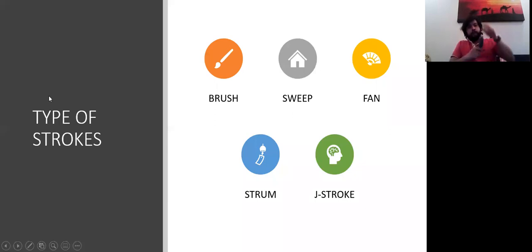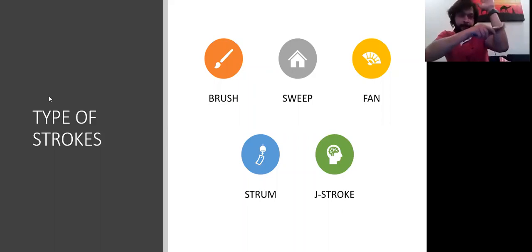Yeah. So let's say I'm treating a part, and for now I'm using my forearm. A brush technique is basically like using a brush while painting. Light, gentle strokes. The brush technique is also used to warm up the area. So if I want to start the patient with an IASTM, this is what I will do.